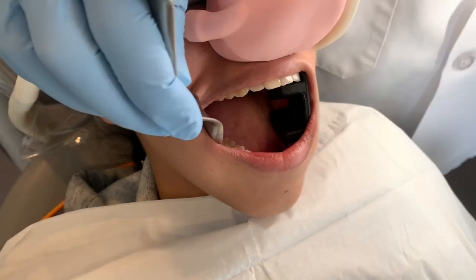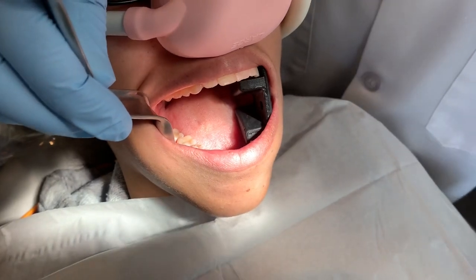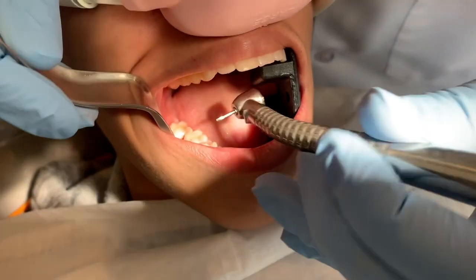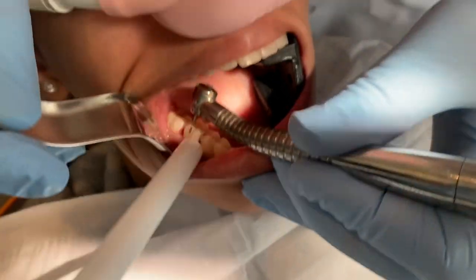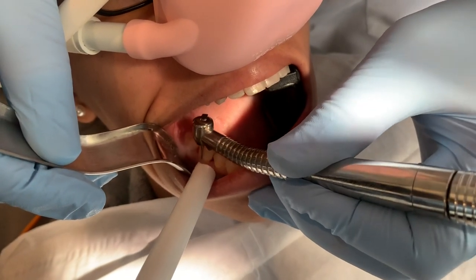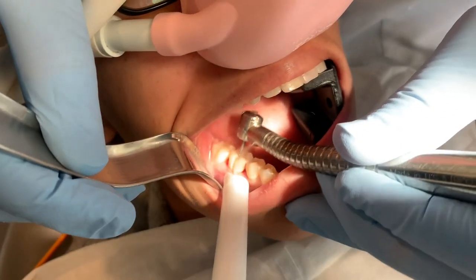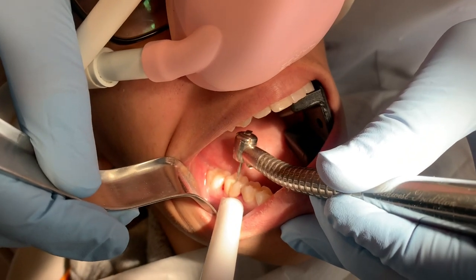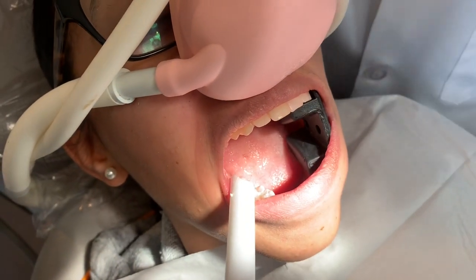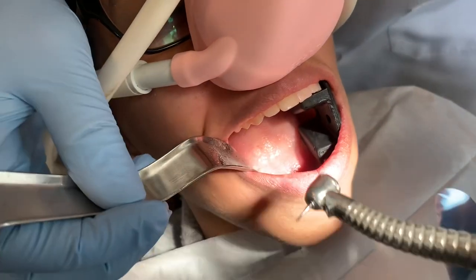I'm going to go ahead and turn the suction on right now, so you're not really going to be able to hear as much what I'm saying. And I'll put my mask on, get ready to go. All right, suction. Does that hurt at all? Mm-mm. Okay, good. Let me know by raising your right hand if it hurts at all, okay? It doesn't hurt, right? Mm-mm. Okay.